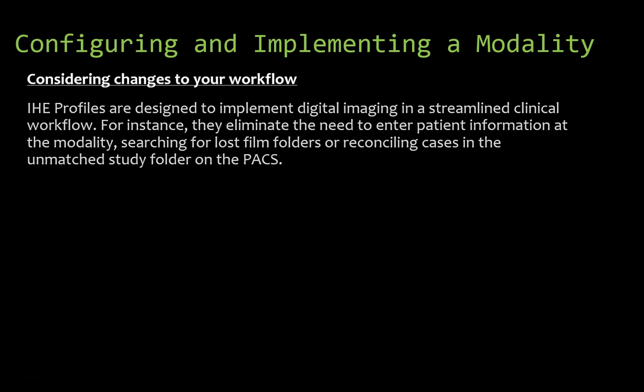Reconciling cases in the unmatched study folder on the PACS, also called broken studies or anomalies depending on the PACS system language, is something the PACS admin does every day. Usually it's a first thing in the morning task.